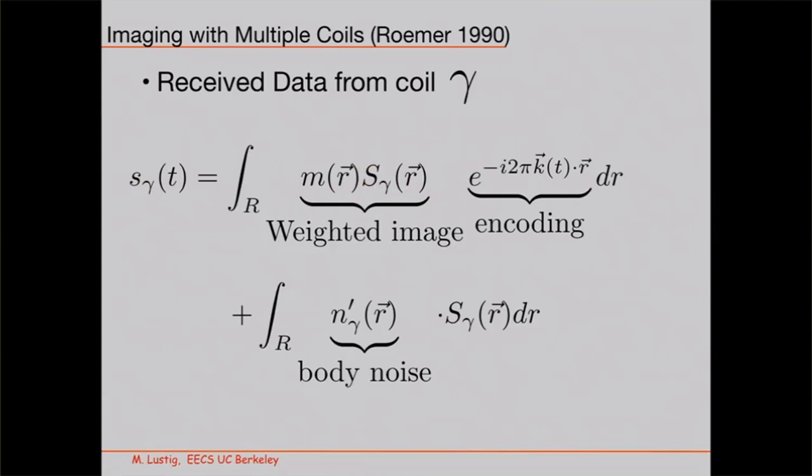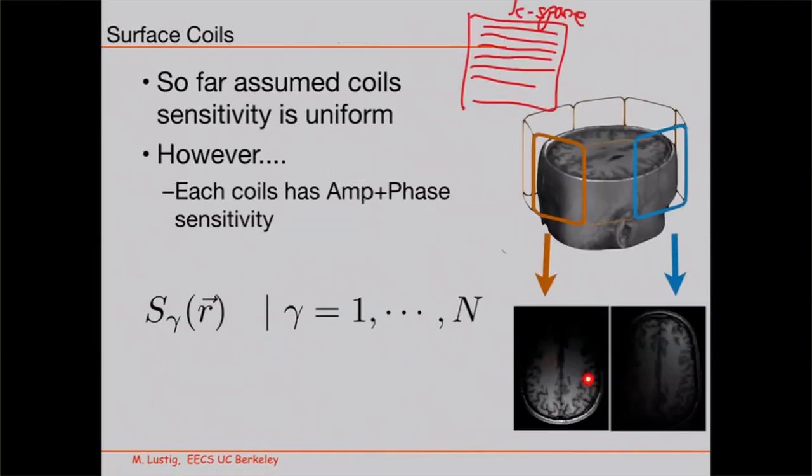So just to illustrate, this product here could be, for example, a brain image that is more illuminated on the left and more dark on the right. Like an image like this one, okay? This is M times S, okay? M is the brain without illumination, constantly illuminated, proton density. But M times S is this image.